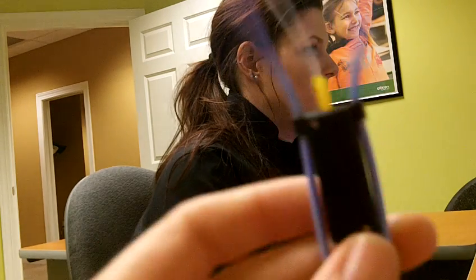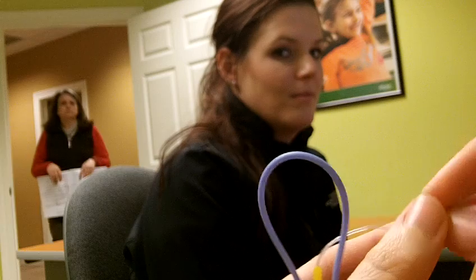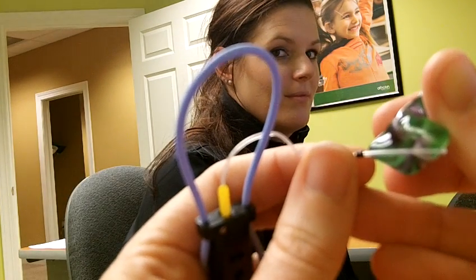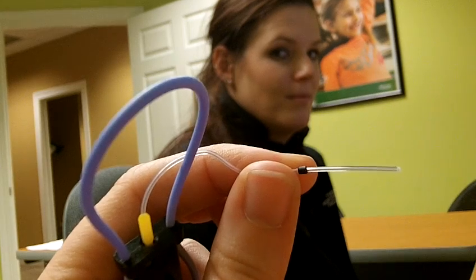You're going to take your probe right here, and you have this in, and it should already be in there from when you calibrated it. And now what you're going to do is lay the ear mold against the probe like so, and you want it to stick out just a little bit further than the ear mold, because you want the edge of the probe to be right next to the eardrum.